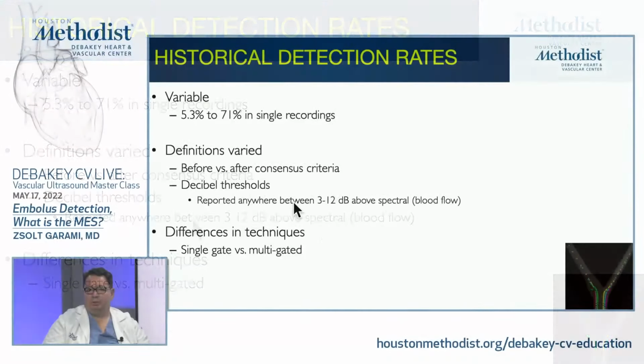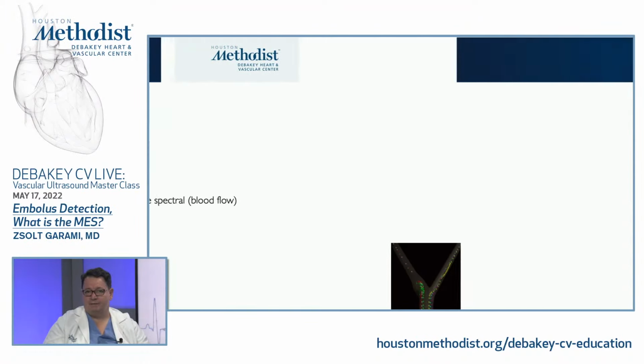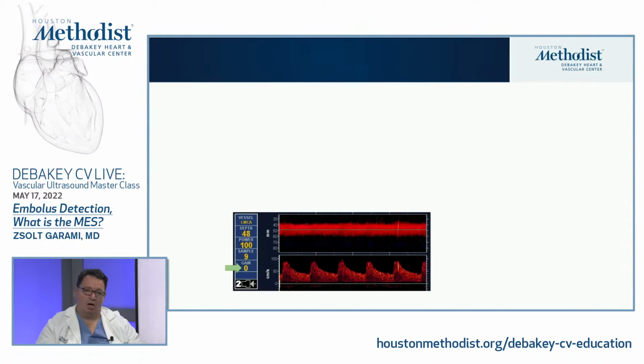So the decibel, we already talked about it. Again, 6 and 9 is more ideal, and we talked about the single- and multi-gate. But definitely the M-mode has really changed our vision. And what I'm going to play you now, I want you to pay attention to the gain. And thank you to Dr. Barato for these beautiful slides.